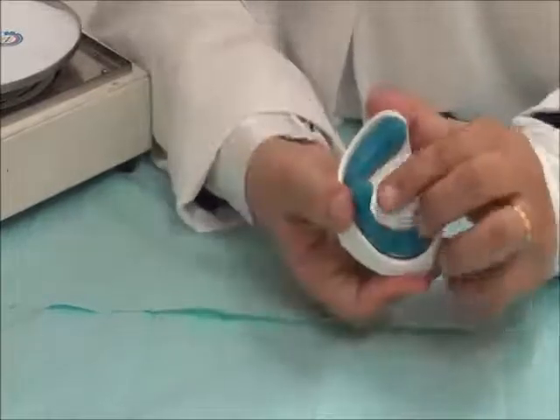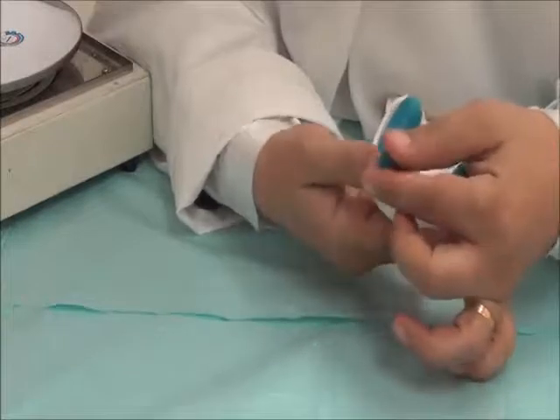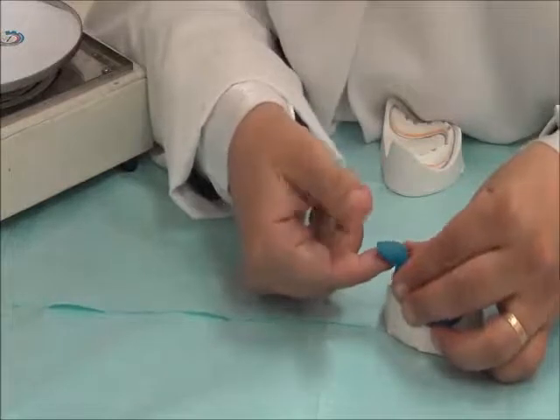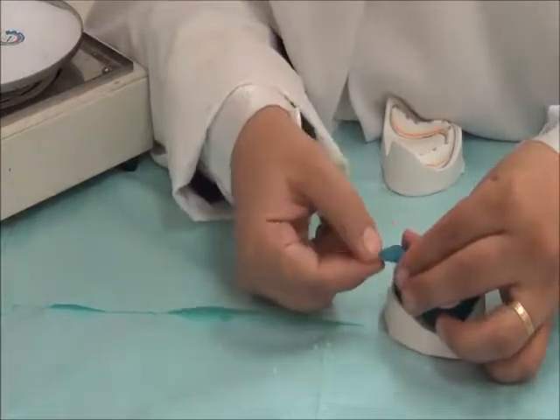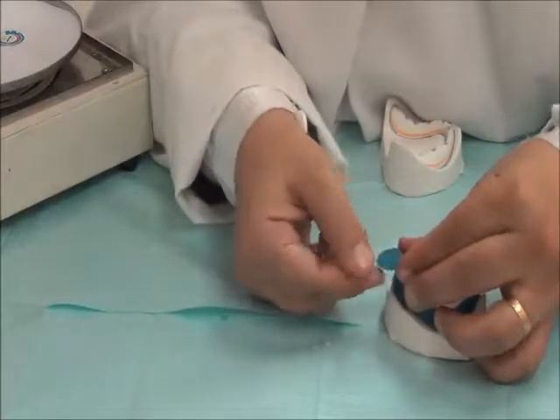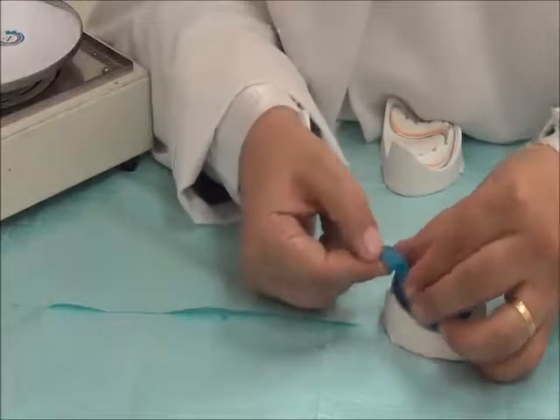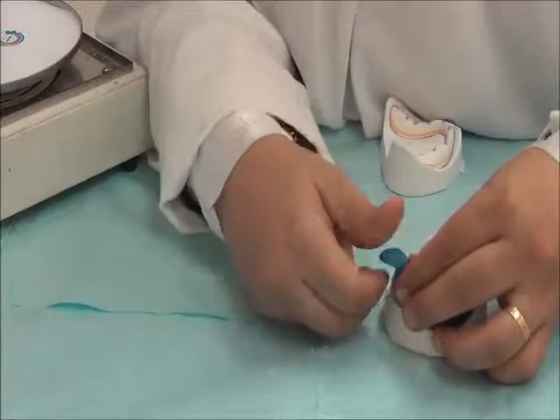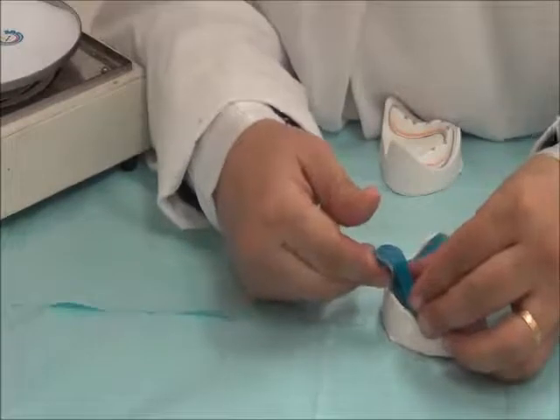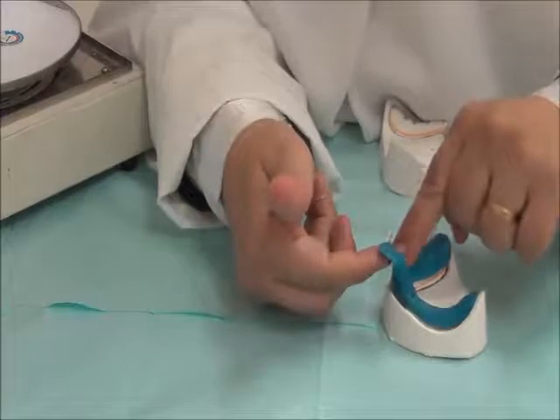We're placing our finger to mimic the lip, and then we go over that distance. So we have preserved the lip length, and over that distance we have bent the handle, and then we flatten it into this shape so that the dentist will have a good grip over this area. So once more, if I leave it, it will slump down. I don't want to cure it while it's still up.